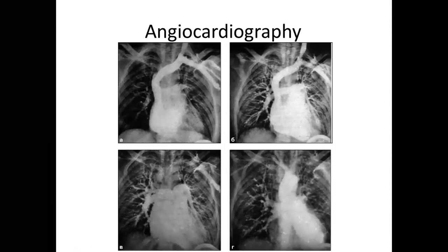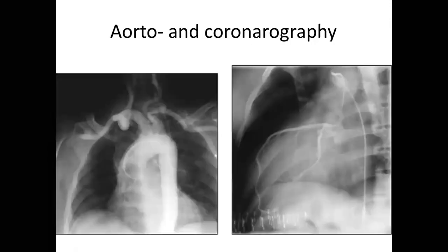And you can see how the pulmonary trunk, then both pulmonary arteries are having this contrast. And this is how contrast looks like on the pulmonary arteries in the pulmonary circle, and then you are seeing contrast in the left ventricle and in the left heart. So you can subsequently make examination of how blood dyed with contrast is moving from the heart to the patient's body.